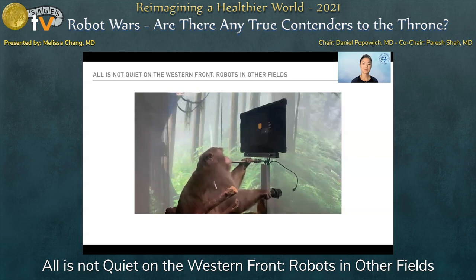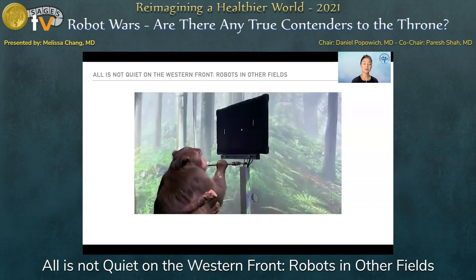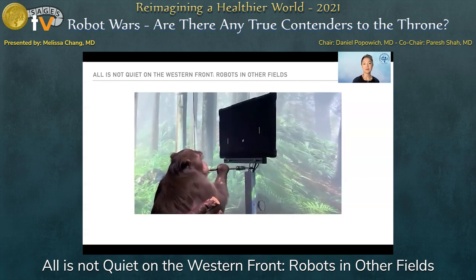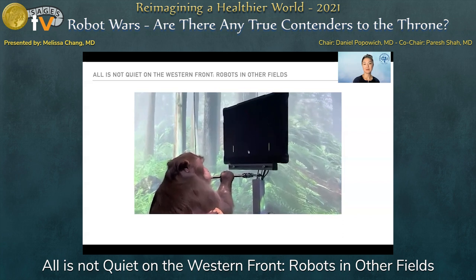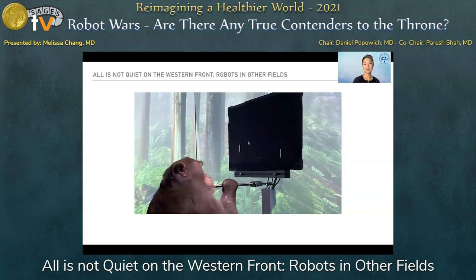Our goal is to enable a person with paralysis to use a computer or phone with their brain activity alone. Because they wouldn't be able to move a joystick, they would calibrate the decoder by imagining hand movements to targets. One of the things the Neuralinks allow Pager to do is to play his favorite video game, Pong. To control his paddle on the right side of the screen, Pager simply thinks about moving his hand up or down. We've removed the joystick altogether. Now that he's up to speed, let's increase the difficulty and see how well Pager can play with the Neuralink. As you can see, Pager is amazingly good at Mind Pong. He's focused, and he's playing entirely of his own volition. It's not magic. The reason Neuralink works is because it's recording and decoding electrical signals from the brain.